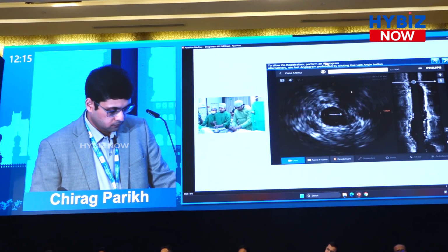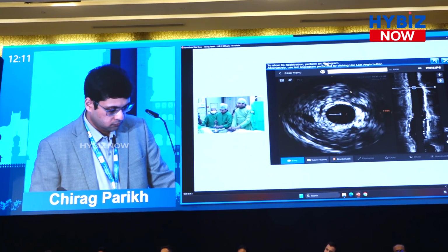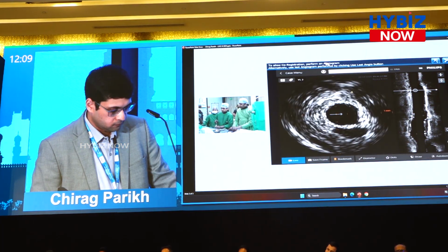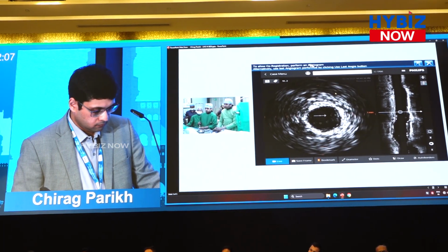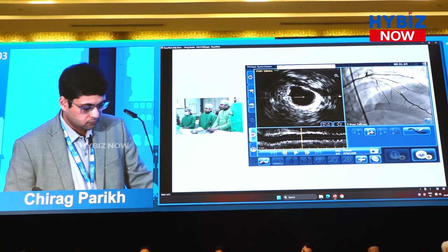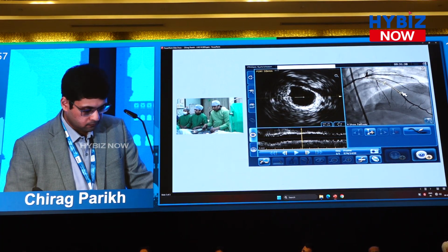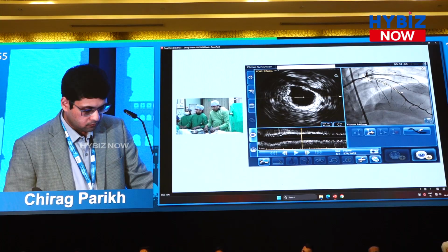The next thing we do is we perform an angio co-registration. So without moving the C-arm, we need to take a cine shoot. The co-registration of the angiography with the IVUS. We can see 2 white dots and a yellow line and a yellow marker. So the 2 dots represent the distal and proximal edge of the IVUS co-registration.